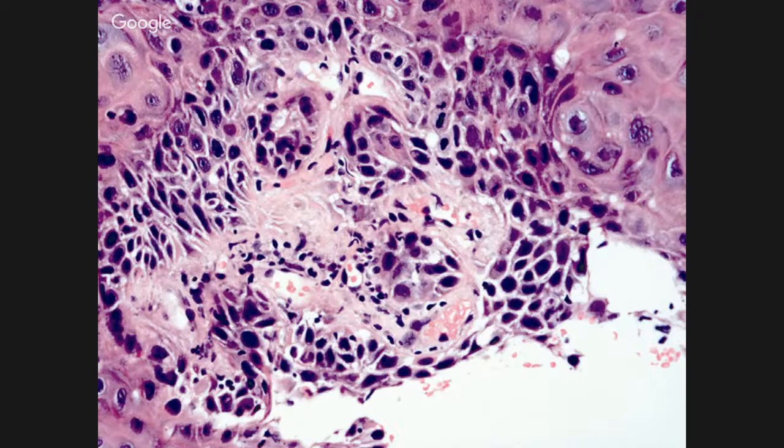So what do we do with this? Is this enough? There's dysplastic epithelium. There's only a little bit of submucosa, but we already know that microinvasive cancer is 0.5 millimeters. This could be that. So this is suspicious, but we need to be careful on how we evaluate these things. But the problem with this is we don't know what's below it because they didn't take a biopsy. So for me, this is suspicious for at least microinvasive cancer.